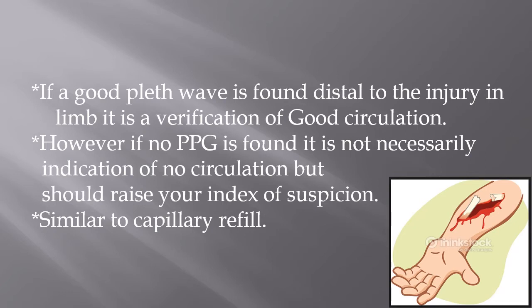However, if you do not have a good waveform, this does not necessarily mean you do not have circulation, but should raise your index of suspicion.